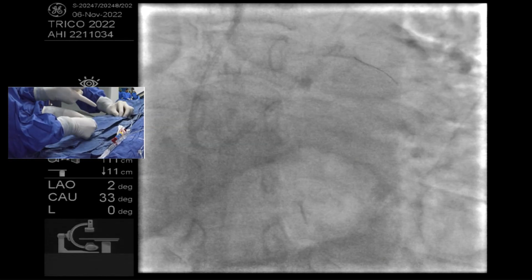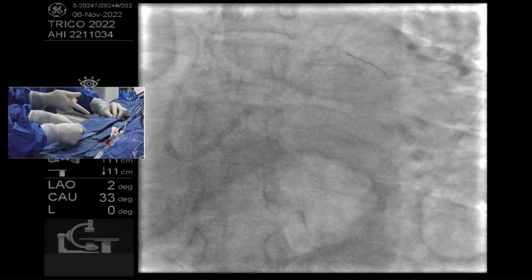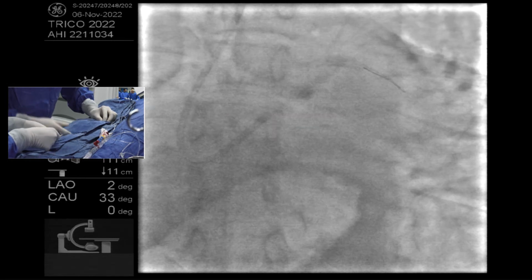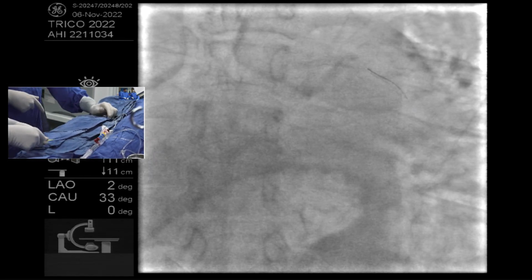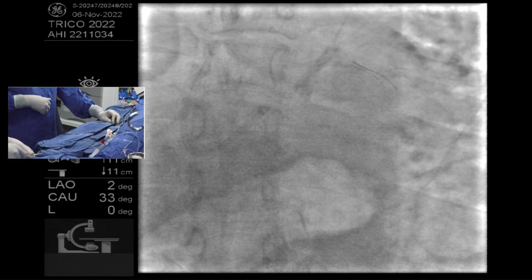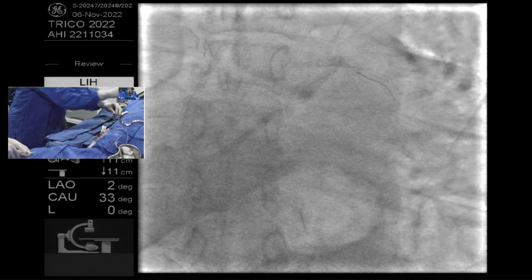Yeah, agree. Well, we'll need to keep the wire clean. It's excellent. You don't want trapping. Excellent. Sorry, I thought it is a guide wire. For the younger colleagues, to start rota, we must engage the guide very nicely.